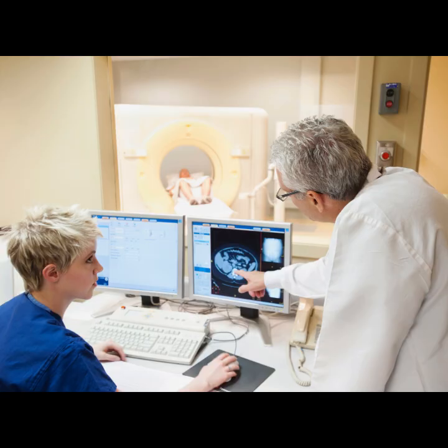And your point is? Instead, we're forced into mathematically intensive methods like the non-uniform fast Fourier transform, the NUFFT, or maybe other specialized algorithms. This significantly increases the computational burden on the scanner's processing unit, right? It introduces delays and potential sources of error in the reconstruction step itself. In a high-throughput clinical environment, that trade-off is often prohibitive. You might gain speed in acquisition, only to lose it and maybe more during reconstruction.